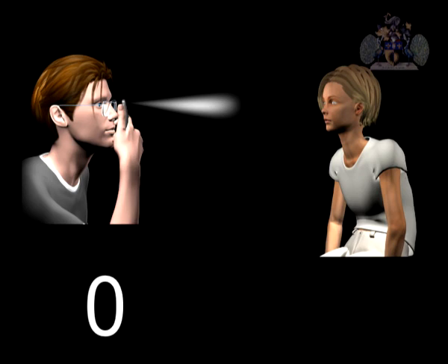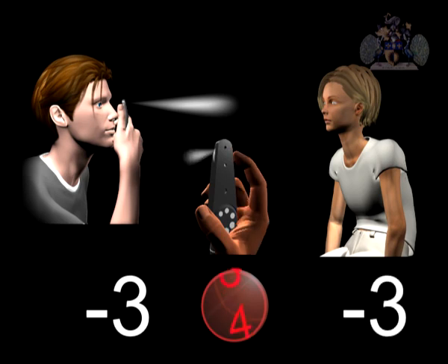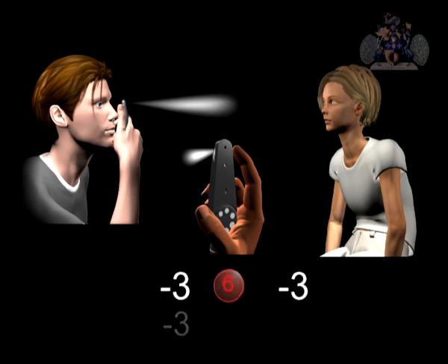If the examiner has a refractive error of -3 and removes his or her distance spectacles, then a red 3 needs to be dialed into the ophthalmoscope. If the patient's refractive error is also known and also happens to be -3, then a further 3 needs to be factored in. In other words, the red dial needs to read 6. The cumulative refractive error of examiner plus patient must be cancelled out by the appropriate lens in the ophthalmoscope for the system to be in focus.